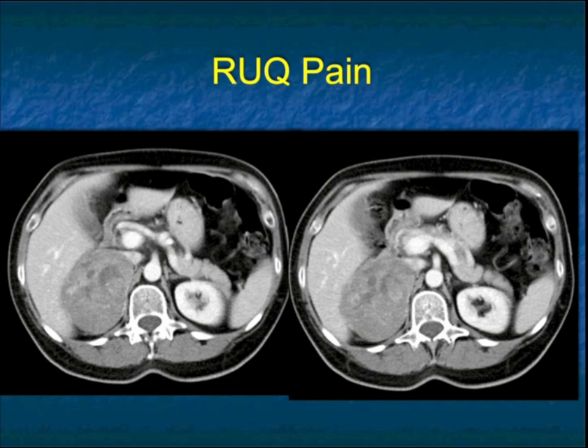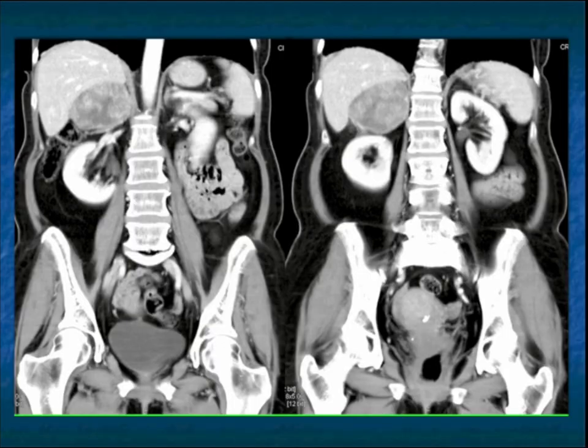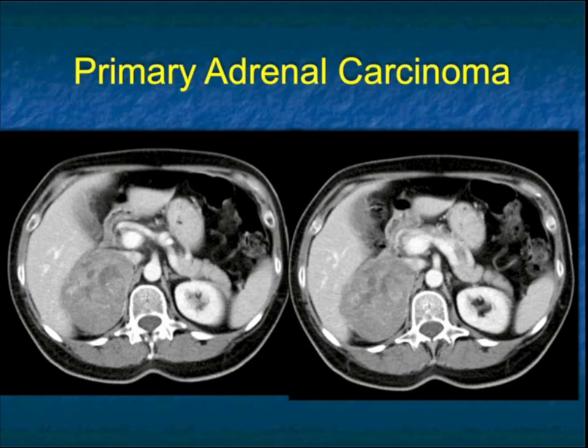Now, this patient presented with right upper quadrant pain, and there's a mass in the region of the adrenal. Now, there's bleeding present. That's why the patient presented. Now, what can bleed? Obviously, adrenal post-trauma. Pheochromocytomas can bleed, but primary adrenocortical carcinomas can bleed, as well as metastasis. I think once things bleed, it's hard to judge how large they are, because some of it is just the bleed. Invariably, this was mass-like, this was resected, and was a primary adrenal carcinoma.